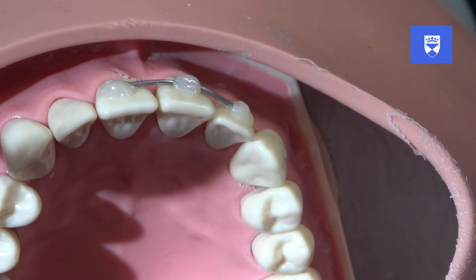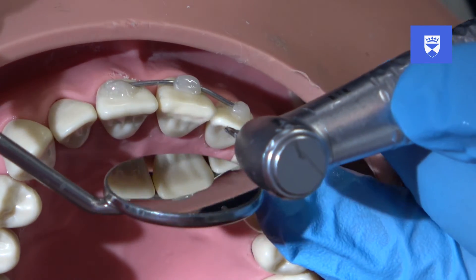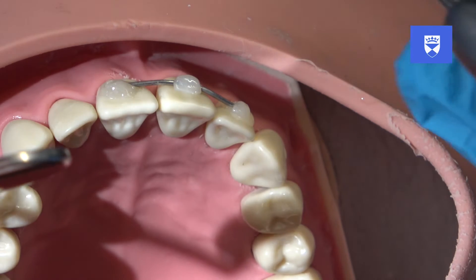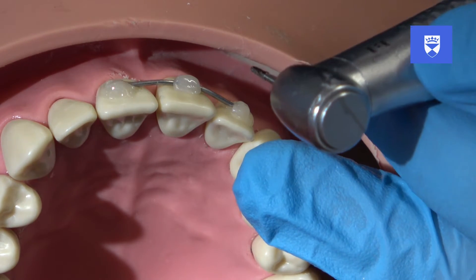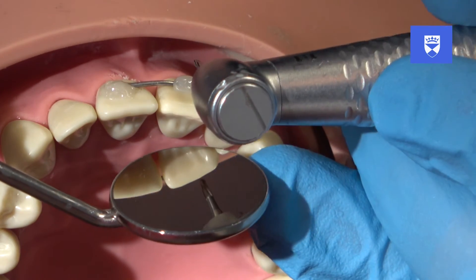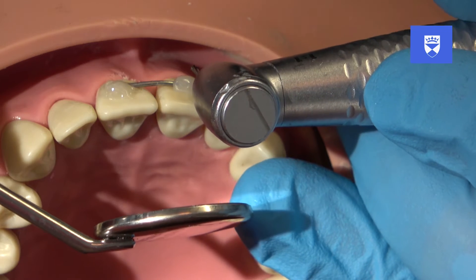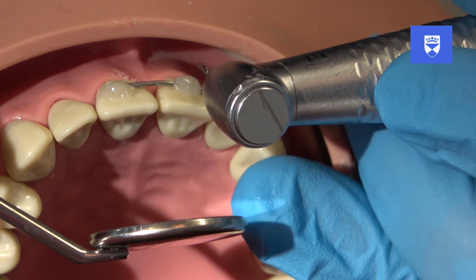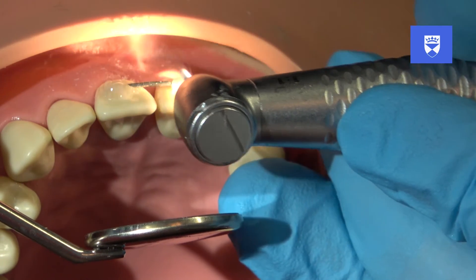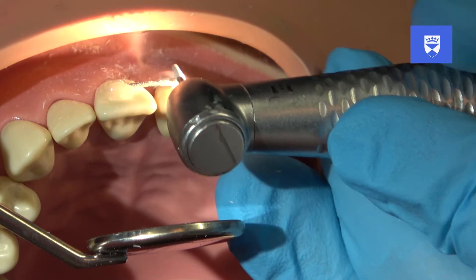Use a slow speed rotary instrument and a tungsten carbide orthodontic debonding bur to remove the composite attached to the traumatized tooth first. Alternatively, composite finishing burrs can be used. If composite finishing burrs are being used with a high speed rotary instrument, water must always be used to avoid excessive heat generation. Whichever burr choice you use, care must be taken to ensure that the tooth surface is not damaged during the debonding process.